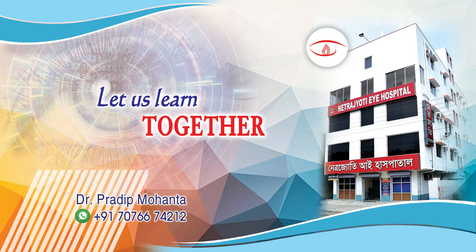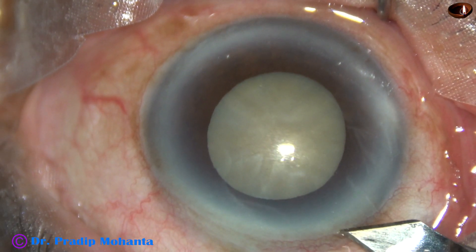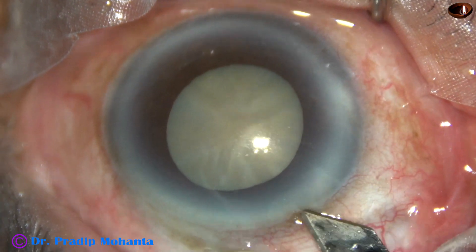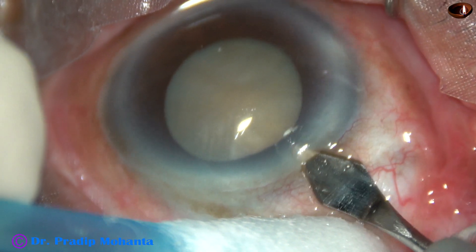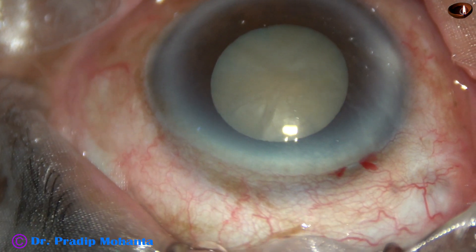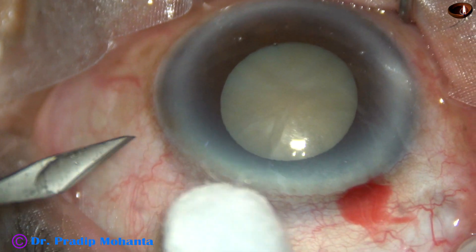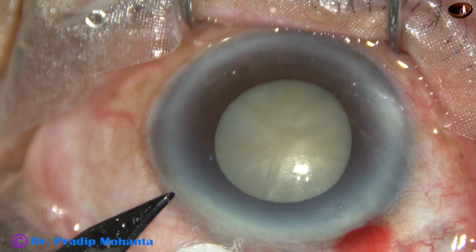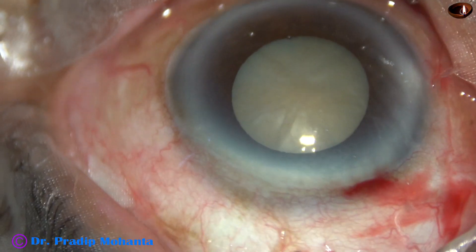Friends, welcome to my workplace at Rana Ghat, West Bengal, India. This is a mature senile cataract. The pupil size at this moment is approximately 5 mm. And if this amount of dilatation remains throughout the surgery, there will be no problem at all. But let us observe this surgery, what happened and how I managed the case.